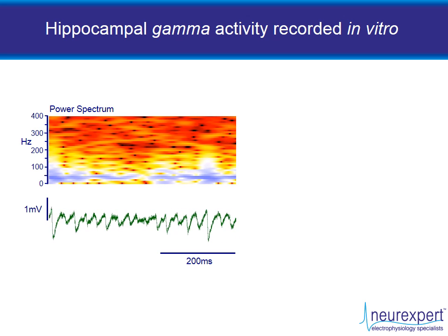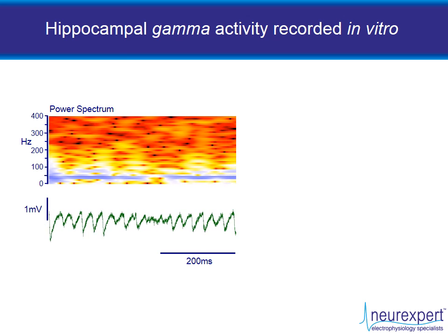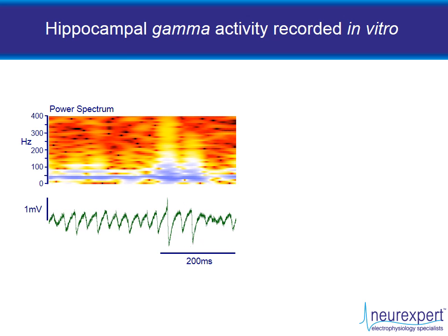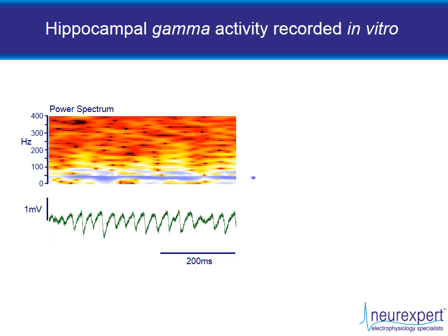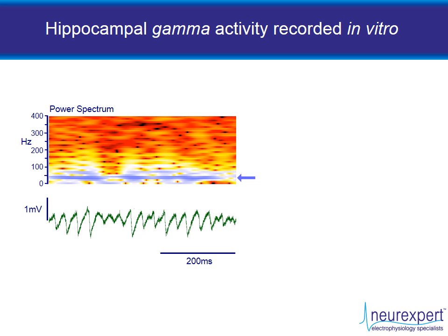In the spectrum, low power is shown as black, with increasing power arbitrarily represented by red, orange, yellow, white and blue colours. It is clear to see that the maximum signal power is in the 30 to 40 Hz range, as shown by the arrow.